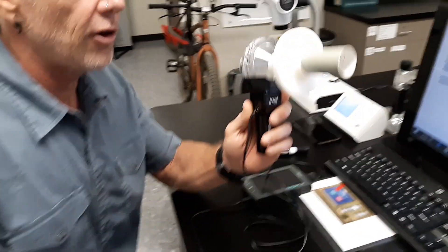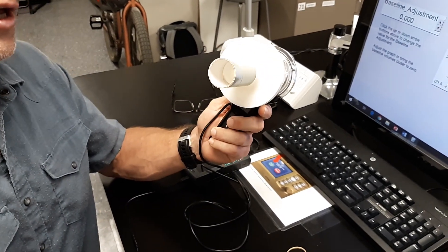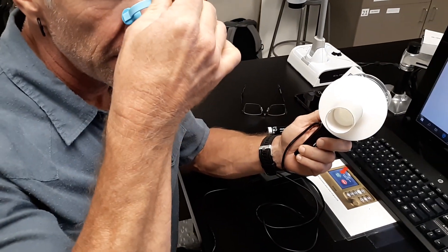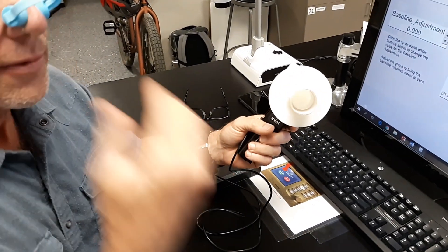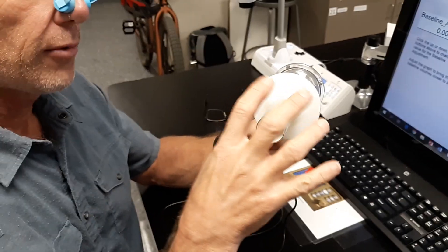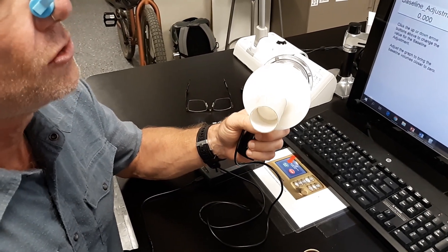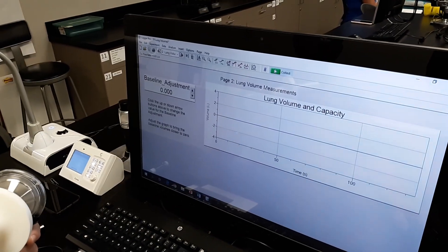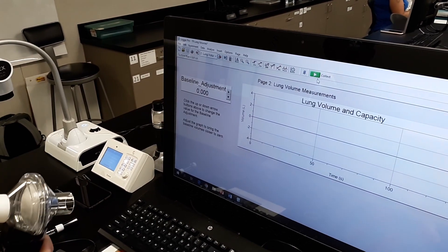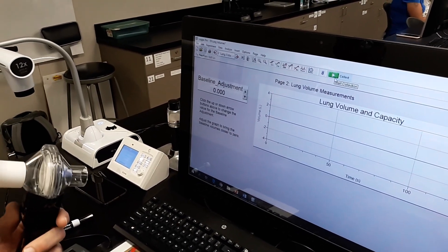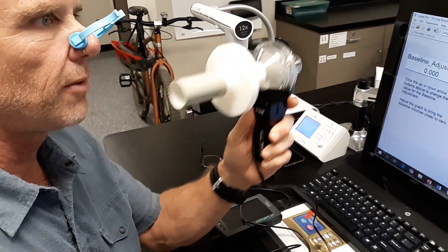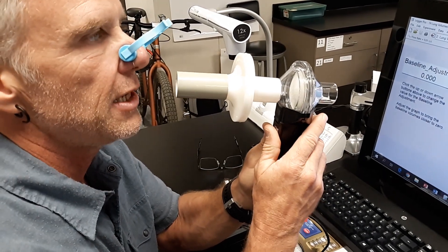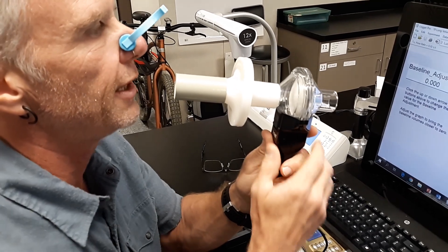And again, we've got our spirometer here. This is the end we're going to breathe into. First thing we're going to do is go ahead and block our nose. That allows us to make sure that all of our breath just goes through the spirometer comes out our mouth. And if you go back to the computer here, you're going to have an active collect button. So that collect button, when you're ready to go, your partner or you are going to go ahead and click on this. One thing about using this is you don't want to be waving around. You want to keep this pretty steady and at a constant level with your mouth.